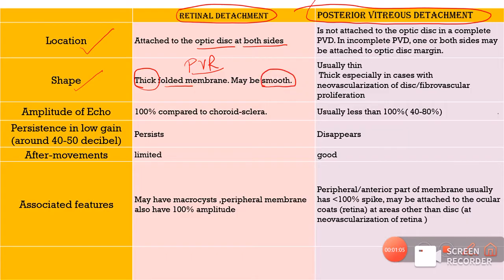The posterior vitreous detachment will usually be thinner. However, in certain cases where there is a vitreous hemorrhage, long-standing neovascularization, or fibrovascular proliferation on top of that vitreous detachment, then that vitreous detachment might also look thicker just like an RD.